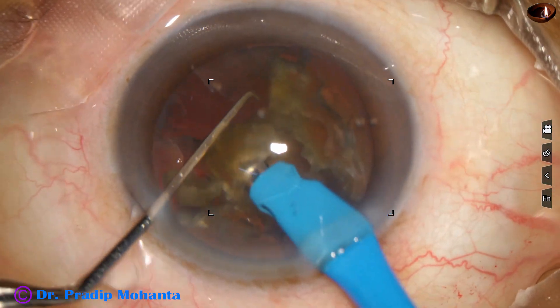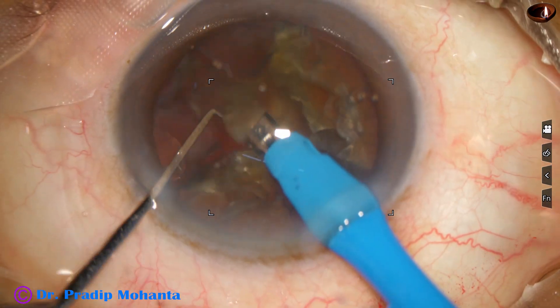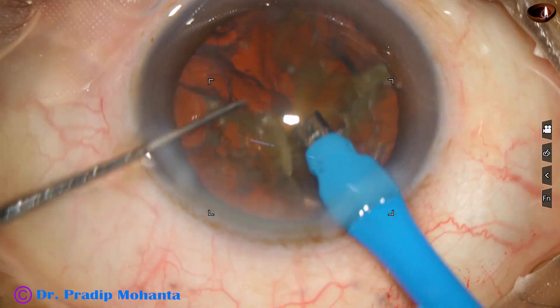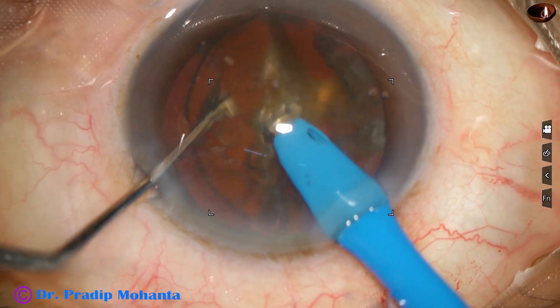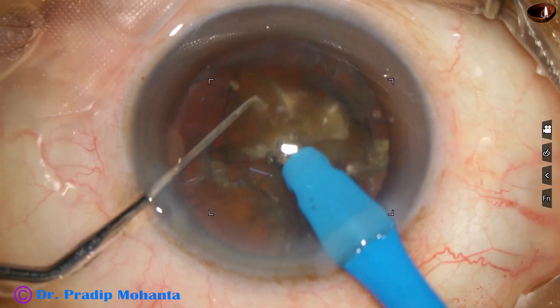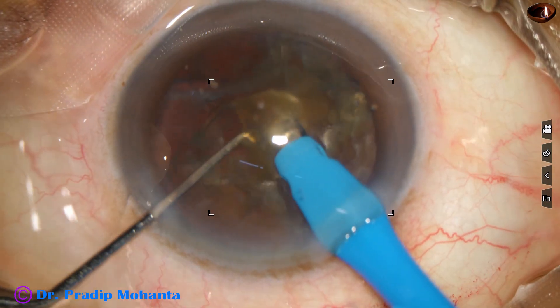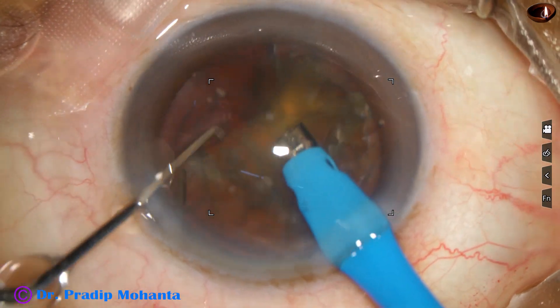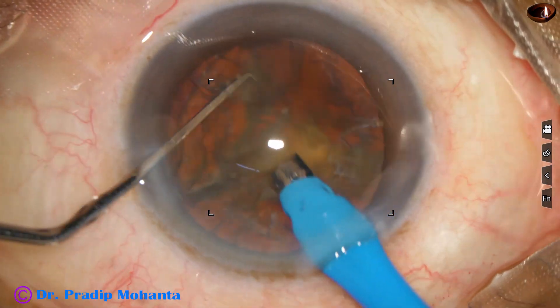Another free piece has been obtained and this piece is being emulsified. By this time hydrodissection has occurred. Hoping that this is a posterior subcapsular cataract and not a posterior polar cataract, I did gentle hydrodissection. So if an incident occurs at the beginning — that is, during hydrodissection — we have no other option; we have to convert the case to SICS.